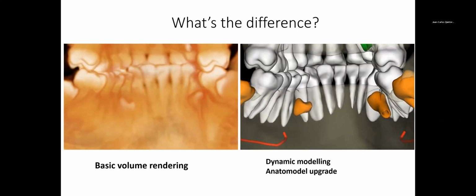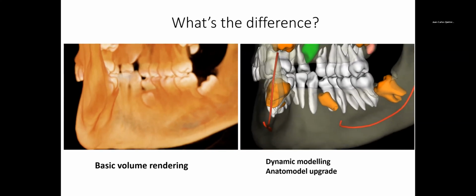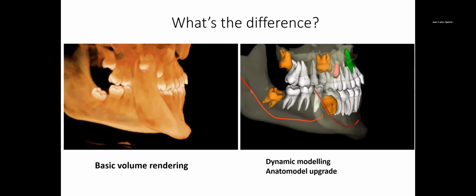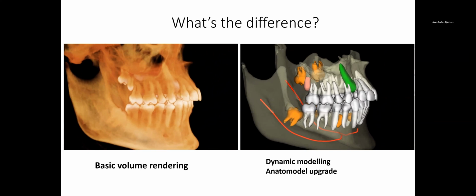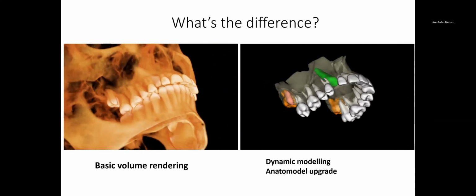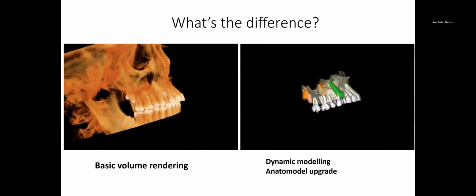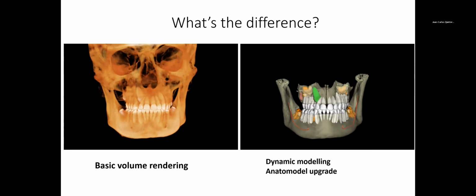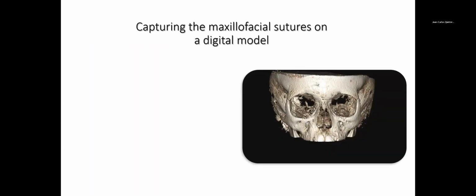They will be so thankful that they know in advance, pre-surgical image-guided navigation, to know exactly where these supernumerary teeth are. Where are those third molars relative to the root, right? So it really leads to more conservative surgical procedures and better management of risk.